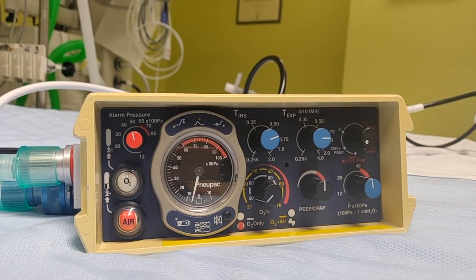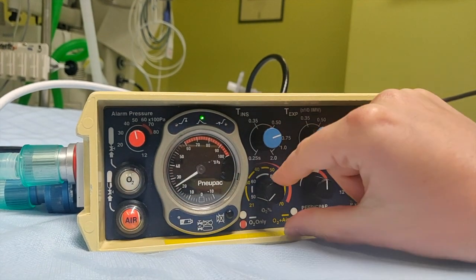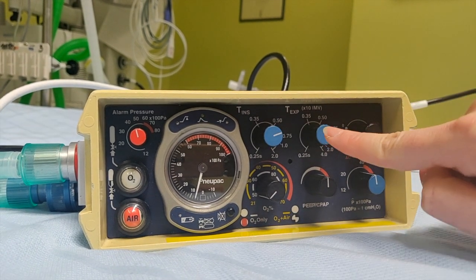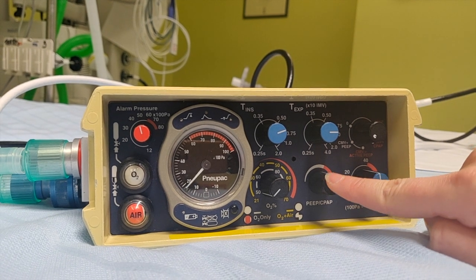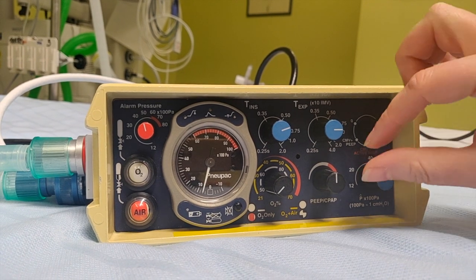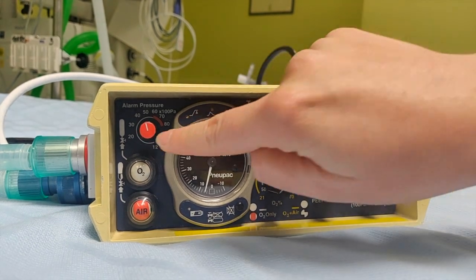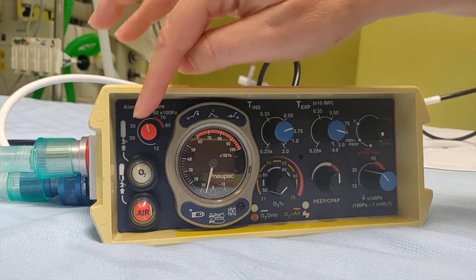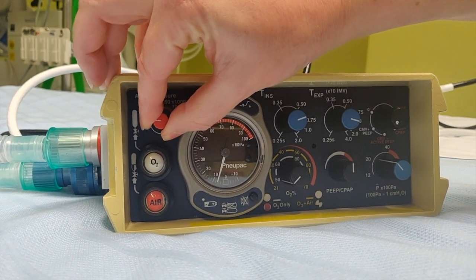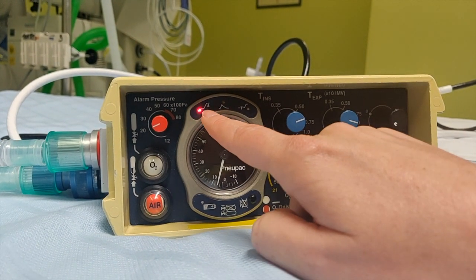So we go back to CMV plus PEEP. We are on oxygen only — air is disconnected — dialed down to 50% FiO2, a rate of 35, a PEEP of around 5 to 6, and a peak pressure of 30. If you want to go up and down, you turn the knobs. And this one, which we didn't discuss, is the pressure alarm. It is very picky, so just be generous with it — but if you drop it too low, it will alarm at top pressure.